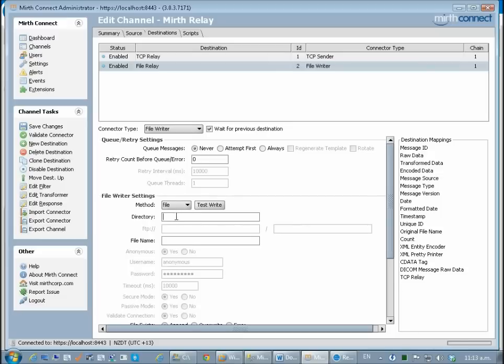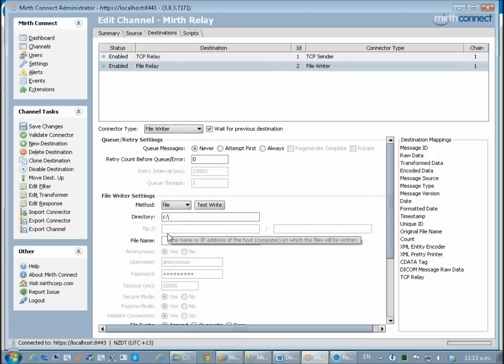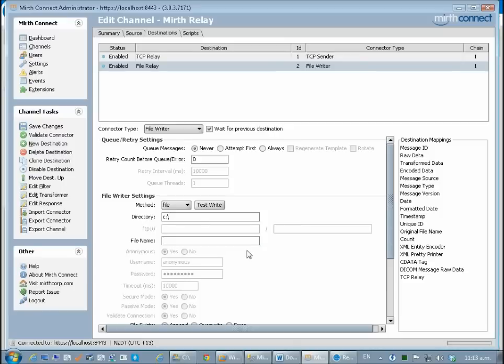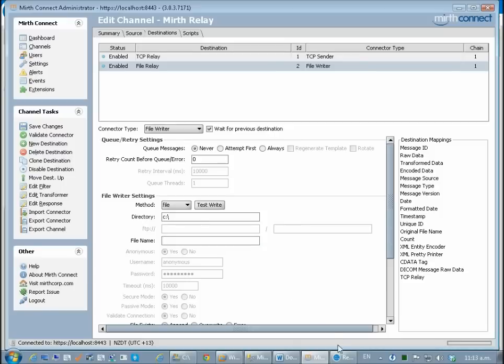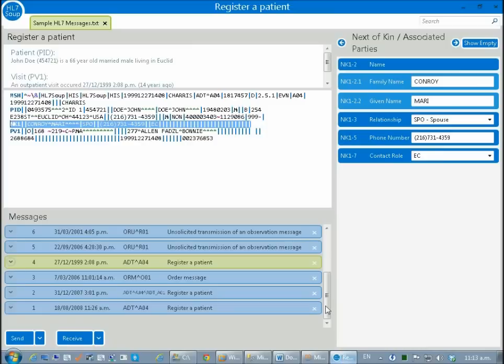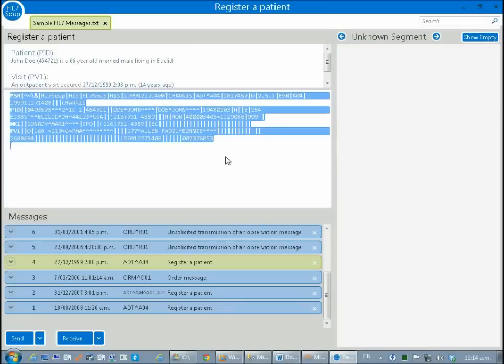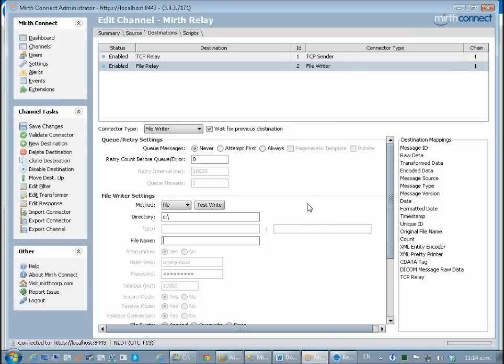I'm going to write this out to my C drive and I want to give it a file name. I want to give it a unique name. So I'm going to copy the entire message to my clipboard and then come back into Mirth. Now I want to get the message control ID out of this and put it in as the file name.